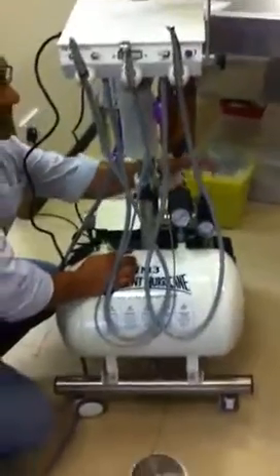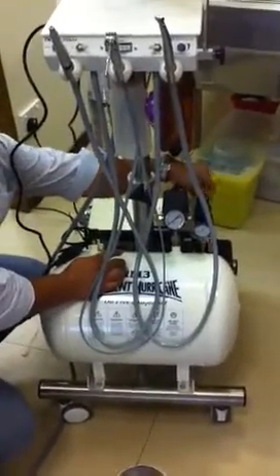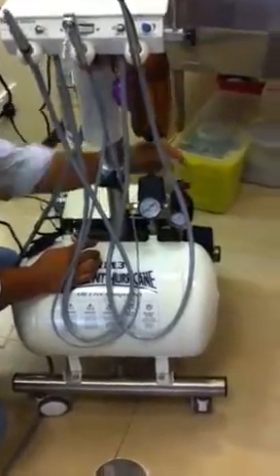Any other questions? This would be the direct valve to feed pressure into the whole system, the head unit. In the head unit itself, when it's in line, it is feeding. When this is off, it is not.